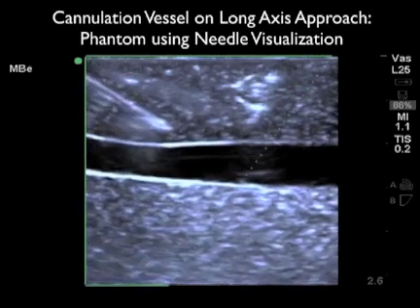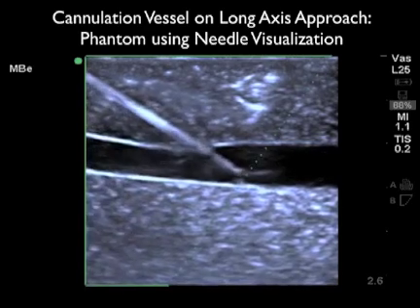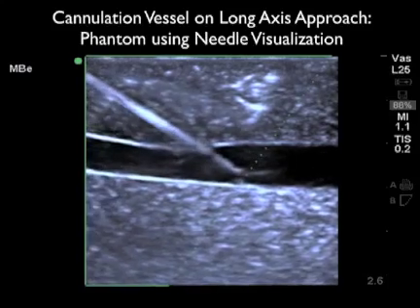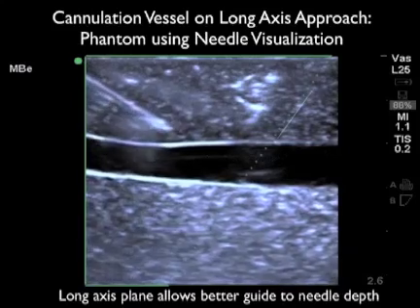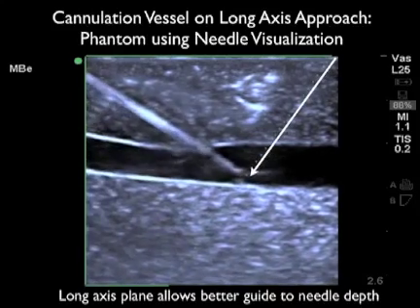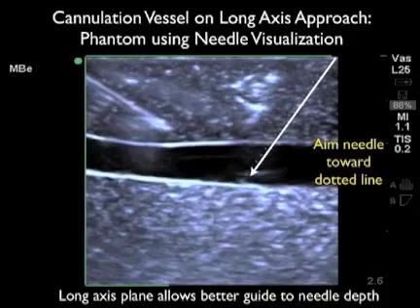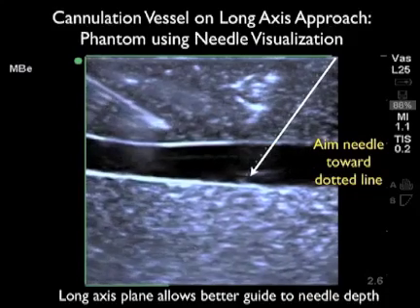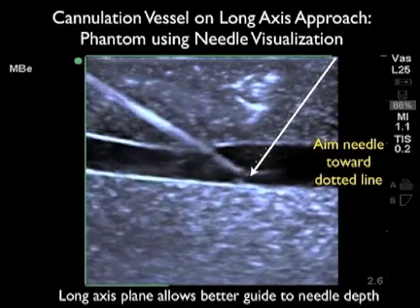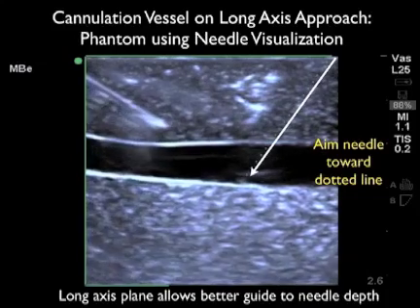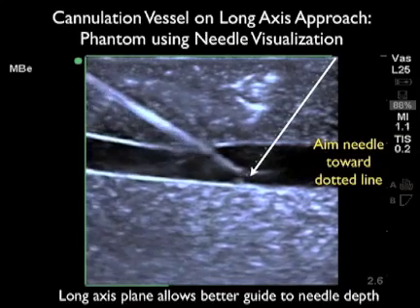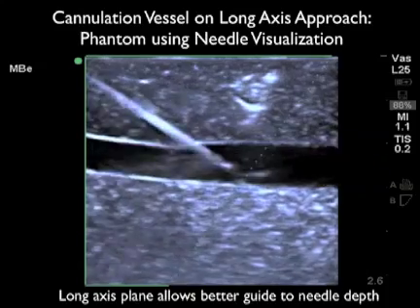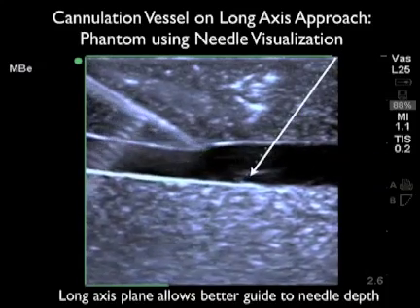In this video clip we'll use the long axis approach for cannulation of a central vein, using MBE technology available on many SonoSite machines which makes the tip of the needle much more echogenic. We aim the needle towards the dotted line on the image. Watching the needle come in from left to right, we can see the full extent of the needle as it travels from superficial down to permeate the anterior wall of the vessel and enter the lumen. The long axis plane allows a much better guide to needle depth, letting you gauge where the tip of the needle is at all times. I generally start with a short axis approach and then flip to long axis.